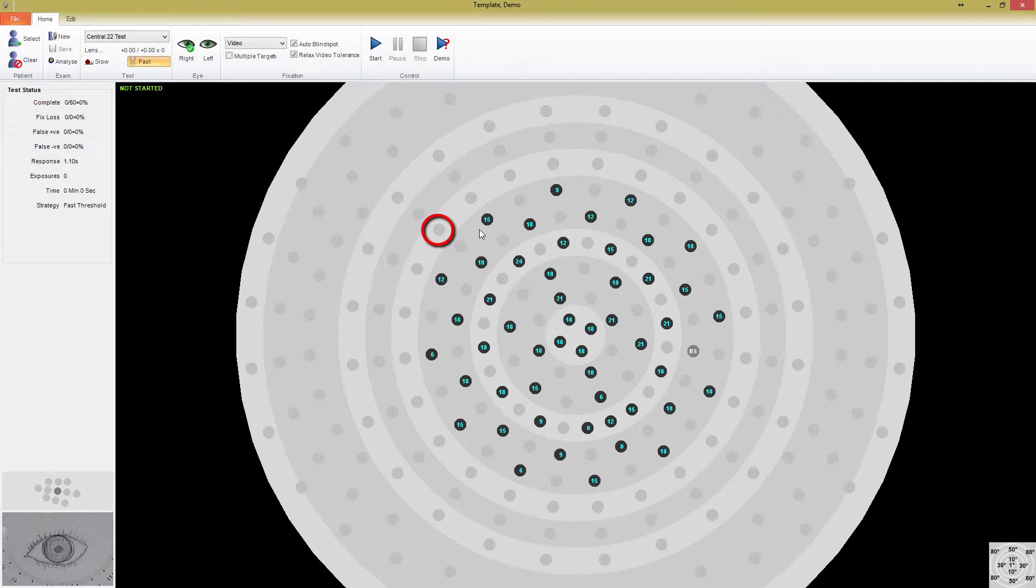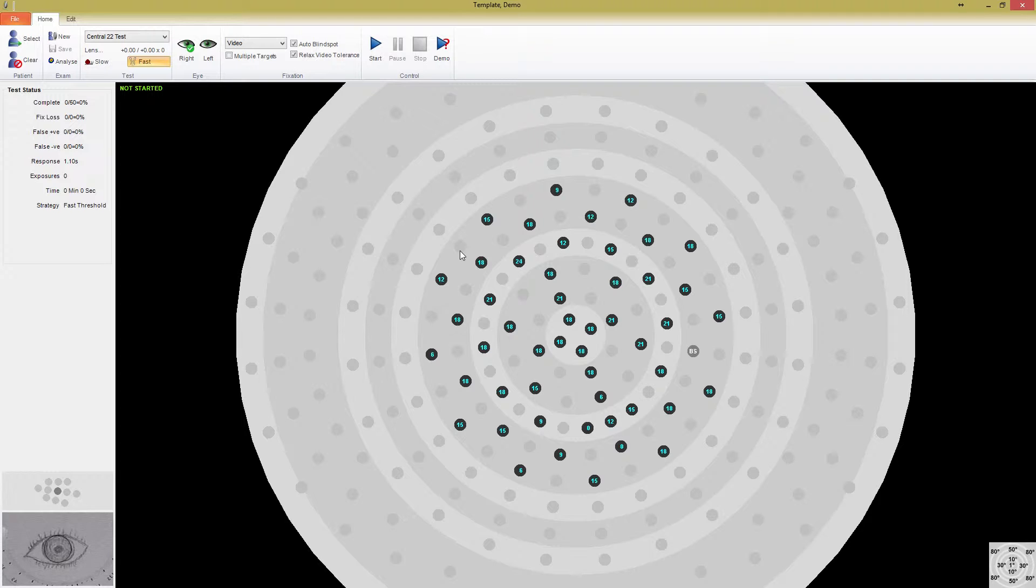Points shown as light gray with no numbers will not be tested. The numbers displayed in the center in blue are the starting exposure levels in decibels. These starting values are based on either the patient's previous exams or the age normal hill of vision. As such, make sure when you're testing a new patient that their age is correct or it may take longer to find the correct thresholds.